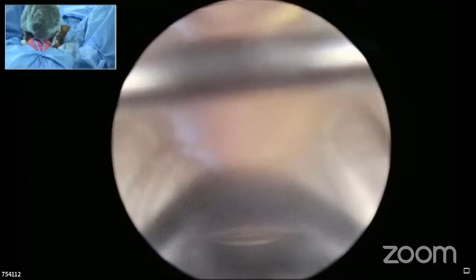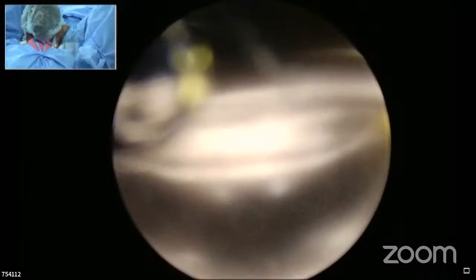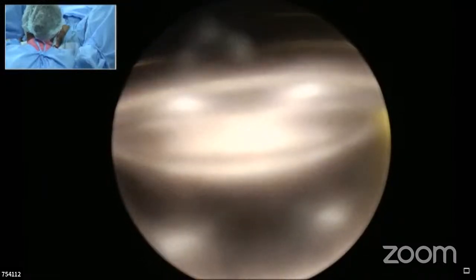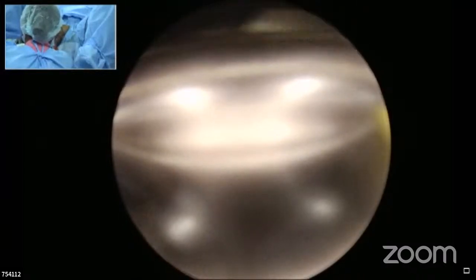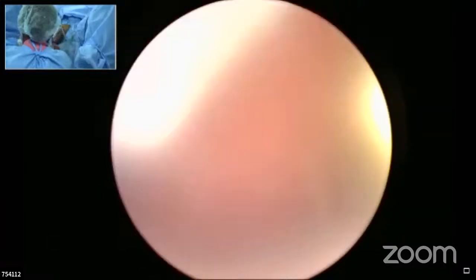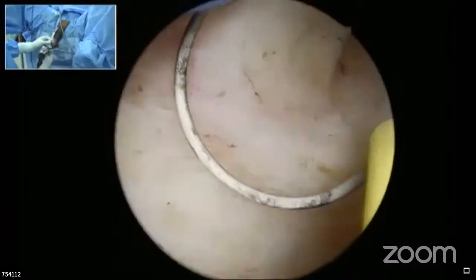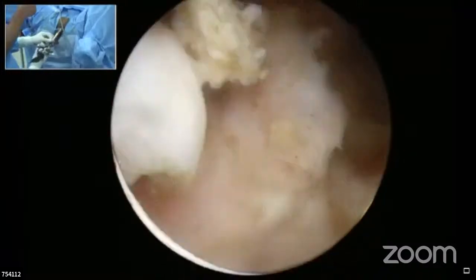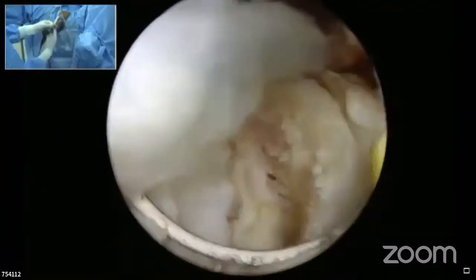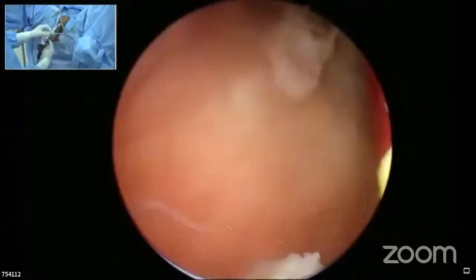We discussed capsular injury and we stopped it there. What are the other ways of managing a capsular tear? See, there are two types of capsular injuries. One starts bleeding whenever you switch off the irrigation; the other doesn't bleed because there was no venous injury involved. The one we are seeing just now is the other type. Except for extravasation, if he doesn't go back to that area and look at it again and again, there's not going to be any problem at all. He can continue.